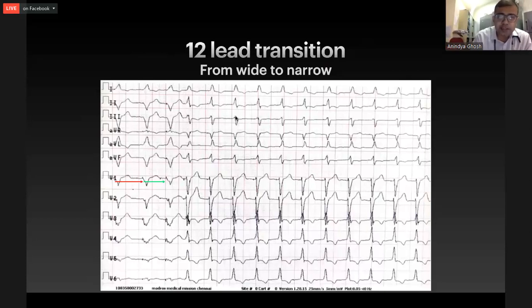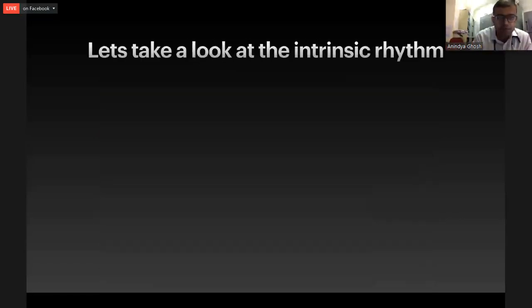Another important thing is that this could not be a pacemaker mediated tachycardia, because the sensing function is obviously off because of the magnet application. So what are the possible mechanisms which we can think of? We were totally perplexed. So we thought of seeing what the device saw on magnet application.